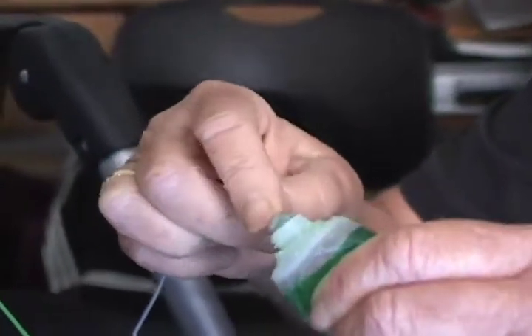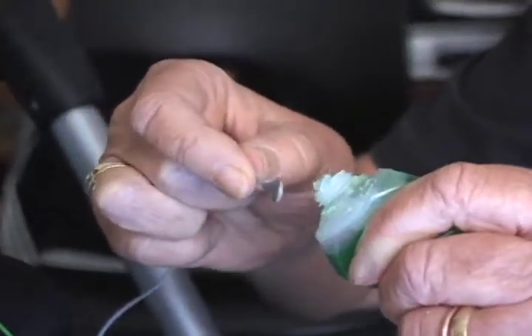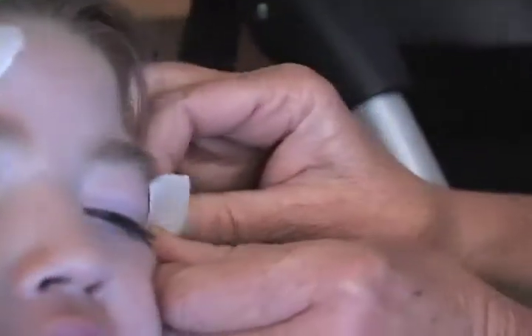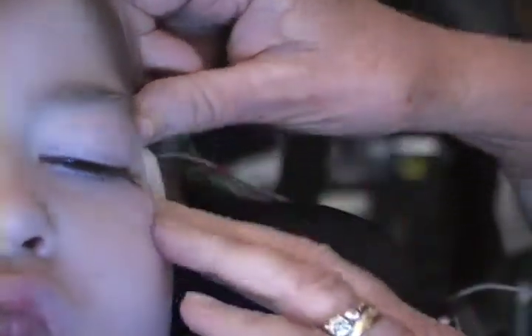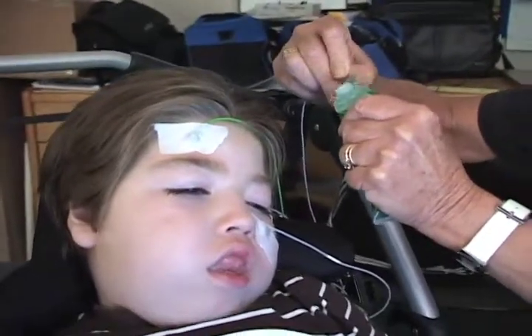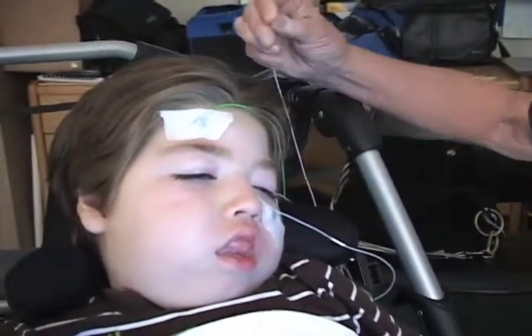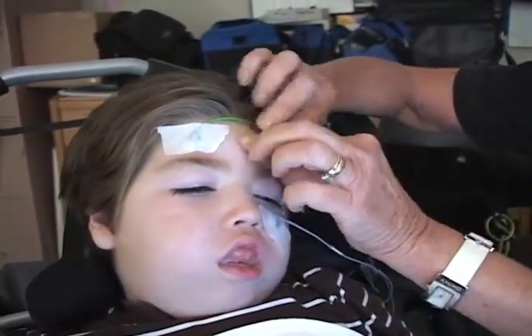Now this is the red cable, and I'm putting it on the lighter gray pad. The red one goes to the left of the left eye. The white one will be going underneath the eye. This is the blue, and the blue one goes above the eye.